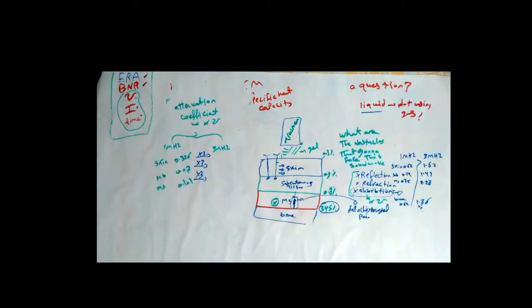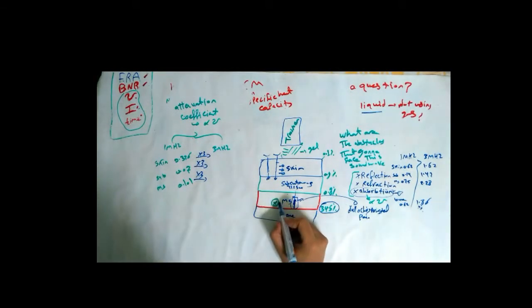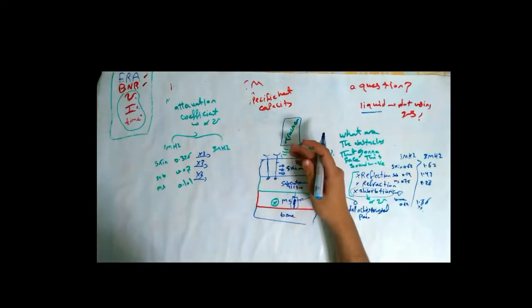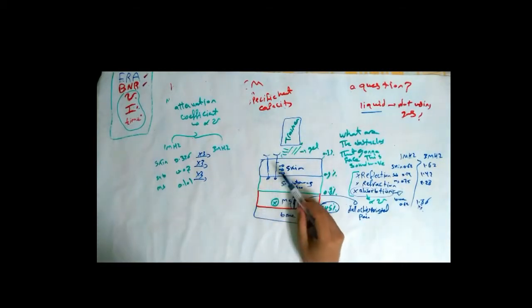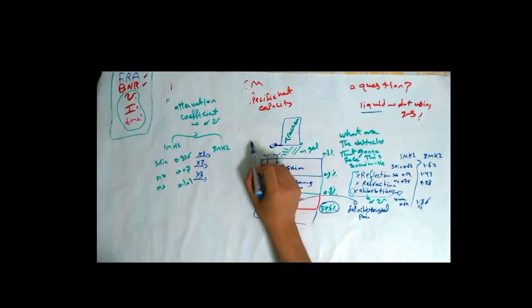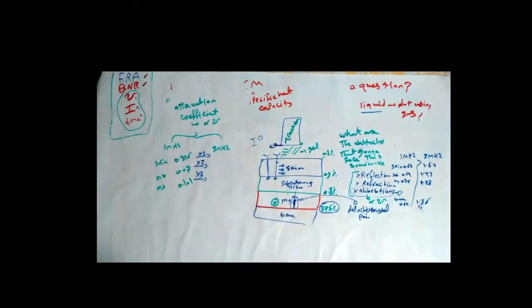Now, if I'm using an intensity to treat an acute lesion of the muscle, since there is energy being absorbed from the sound wave, the intensity at the transducer head, which I put on the device, which is I0, will always be greater than the amount of intensity that will be at the lesion site.